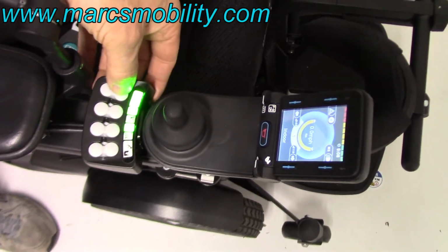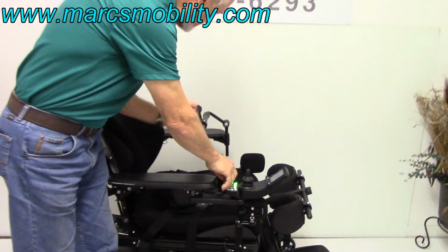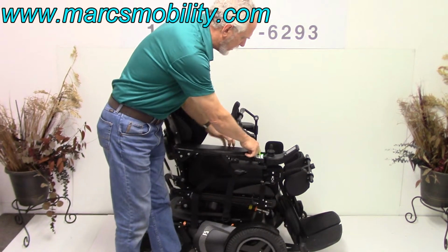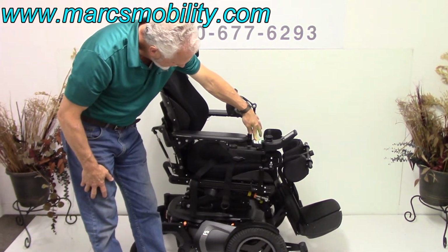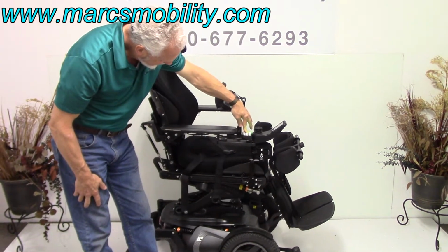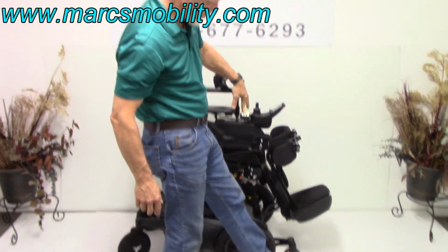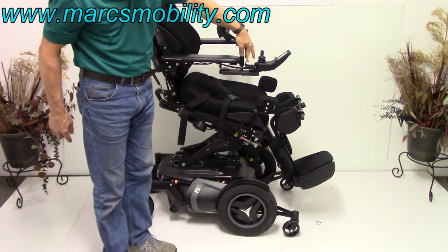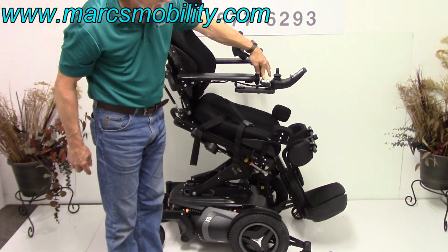If I hit this button here, the chair will start lifting up. There's an owner's manual here with all the information. Now you see the seat lift is starting to go up. Now you will also notice these wheels right here will go down, the tip wheels, they're starting to go down now. You see they're going to go down to the ground to give you suspension in the front, and now you'll be standing up.